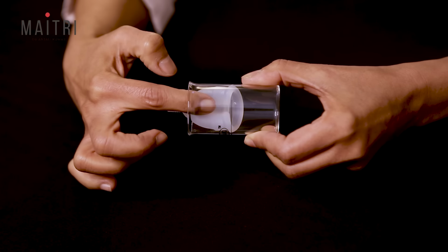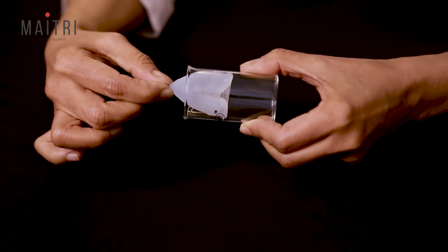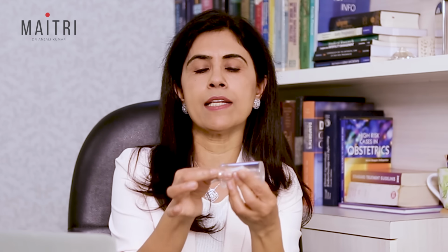Now if you see, sometimes the cup does not open up nicely. So you move a little bit and now the cup opens. Now if you try to tug it outside, it does not move. That means there is a tight seal inside. In case the cup does not open properly inside, you will actually be able to feel a notch here. In that case, you just have to slightly move it this way or that way, and now you can see it's nicely placed.